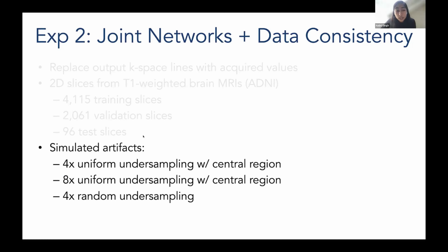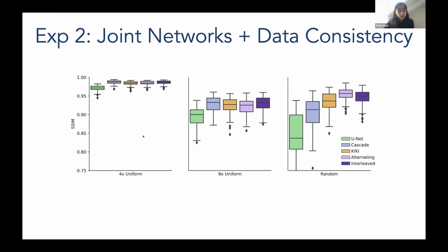This isn't a typical undersampling pattern that would be used on an MR scanner today, but this is looking forward to applications that other people are working on, where people are also trying to use machine learning techniques to optimize the undersampling pattern that's learned in real time on the scanner. And so this is a stress test to see whether our reconstruction method could handle these really highly variable undersampling patterns. So here are results for those experiments.